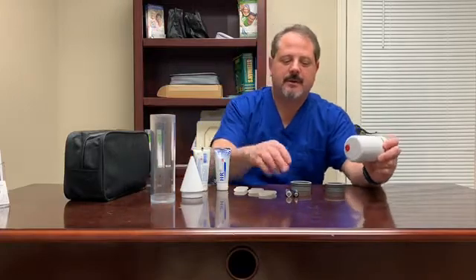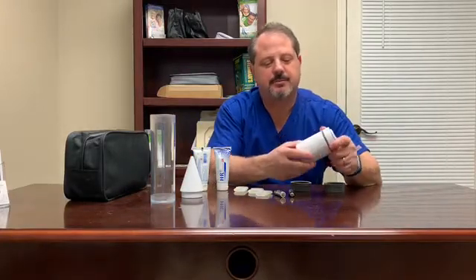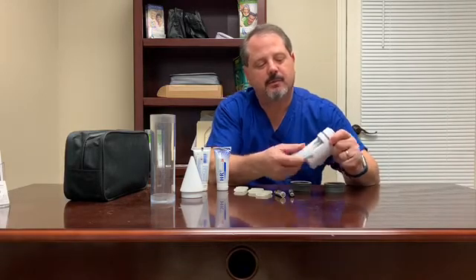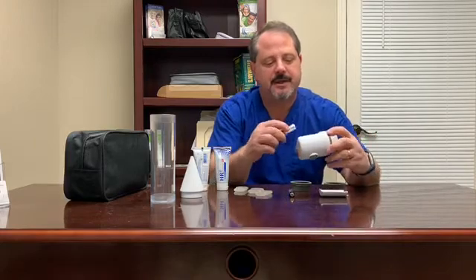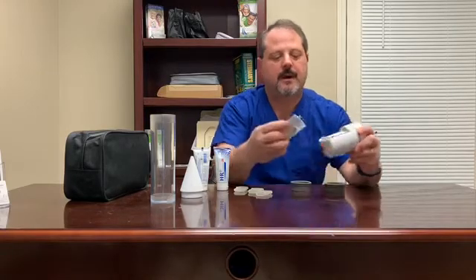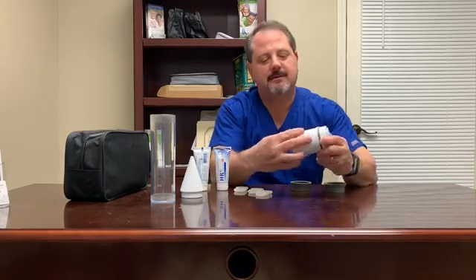It comes with the battery-operated system. This is a two-battery system that operates on AA batteries, which come with the kit. To put the batteries in the system, you simply press the imprint on the back and attach your batteries in, and then slide the back on until you hear a click, and then you know you're ready to go.